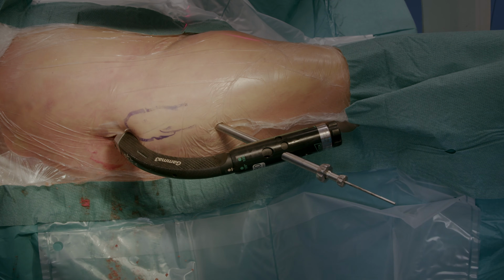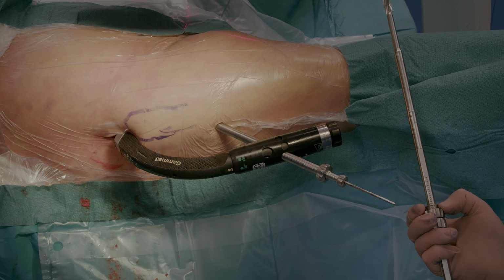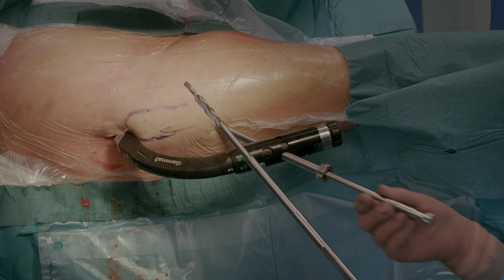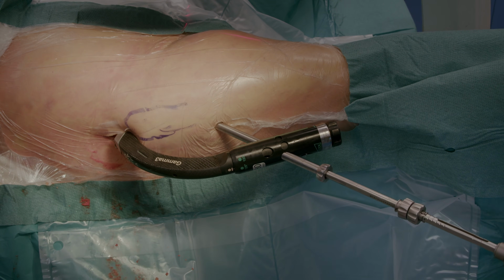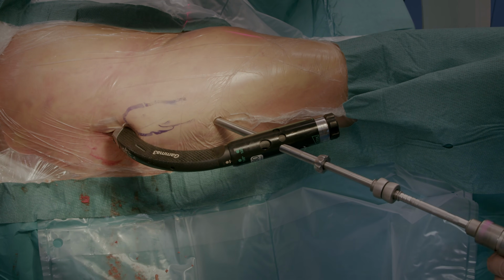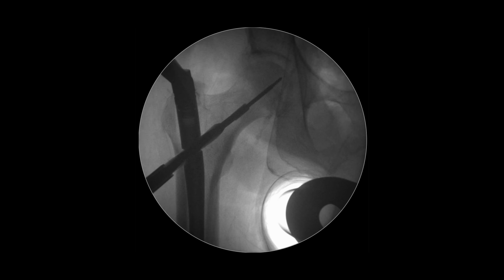We then drill a tunnel for the lag screw. The drill is adjusted to the correct measurement of the lag screw chosen before, which we've now chosen to be 105 millimeters. We remove the inner trocar. And we check the position using fluoroscopy like this.